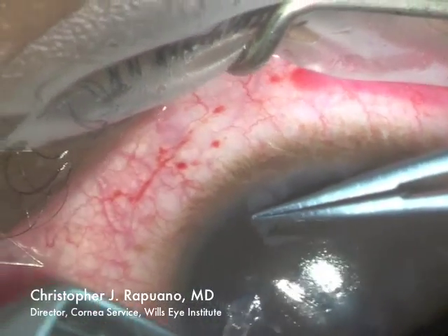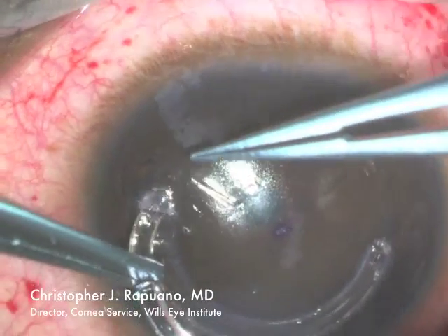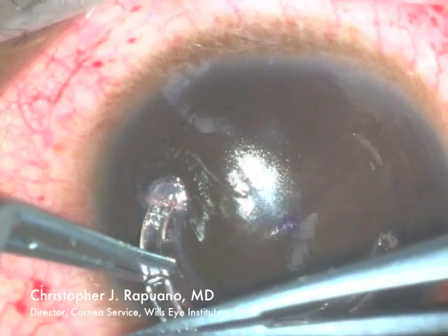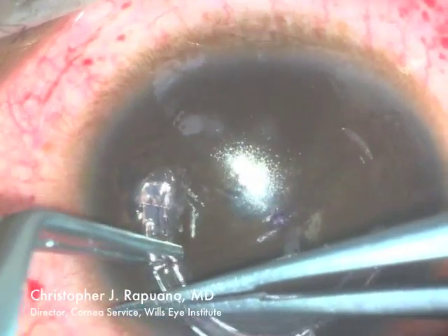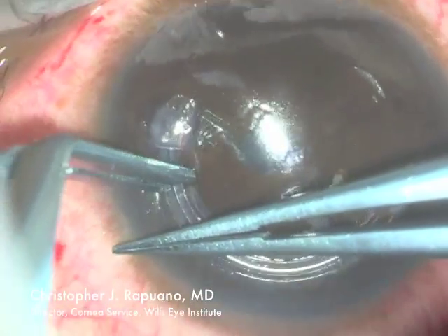Now the superior intacs segment is being placed. Again, it's a little trickier to get the second one in compared to the first one because there's already space being taken up by the first intacs segment.